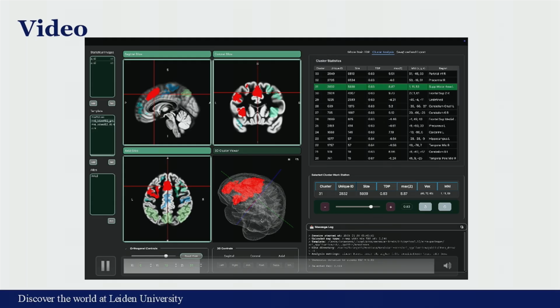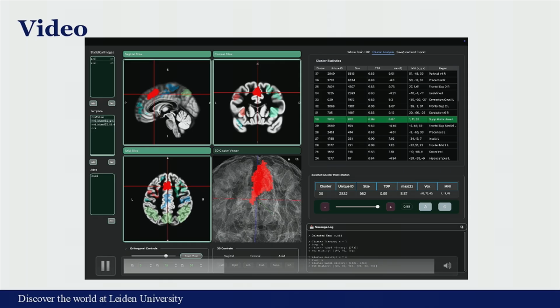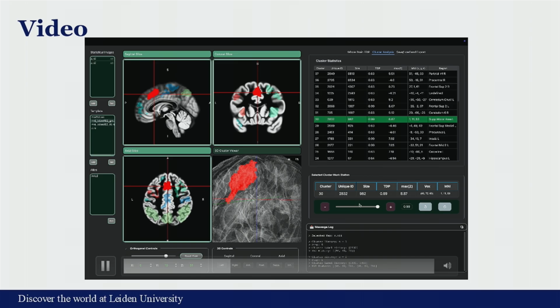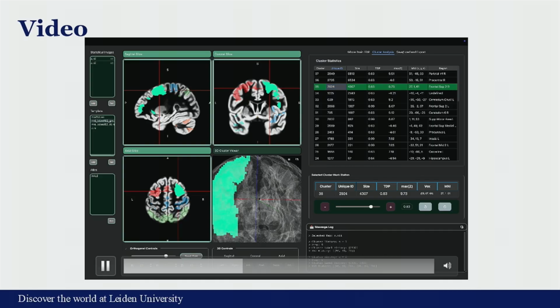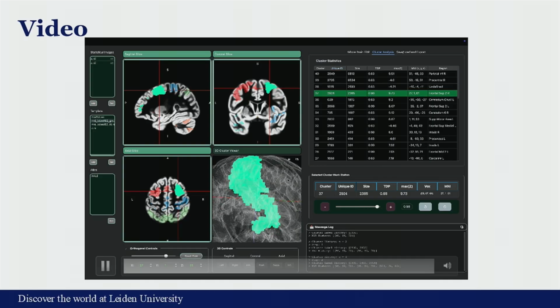And then we can adjust the TDP threshold of that cluster. As you saw, it was increased, so it's reduced in size. It jumps in the table to a different order. We might want to go for another one, and I don't see the clock. But okay, so it goes on a little bit, but it's basically what I explained before.